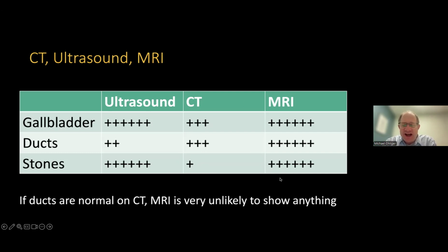We'll get to MRI, and again, I'm biased, so I should have put that in my disclosure, I'm a huge fan of MRI, and it's what I've done for most of my career.